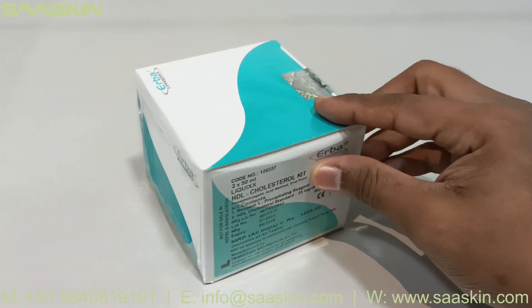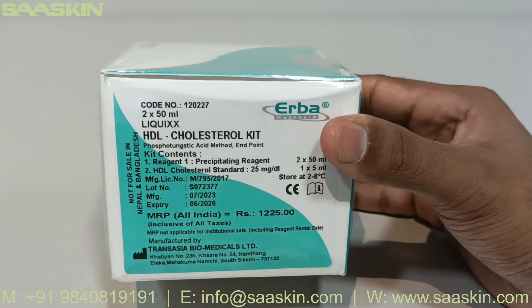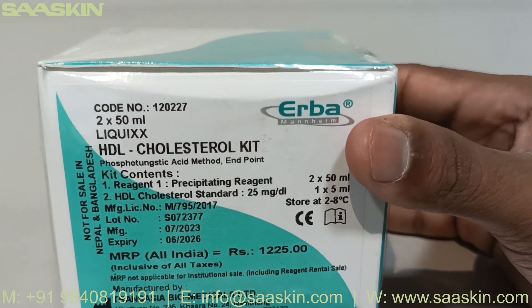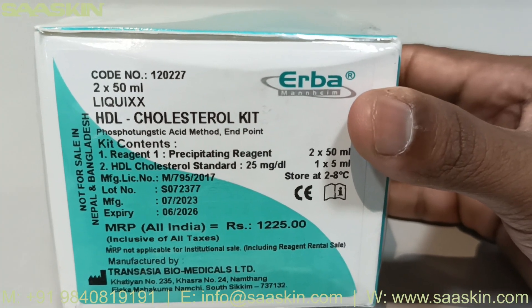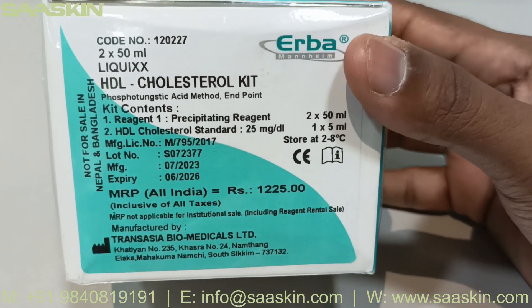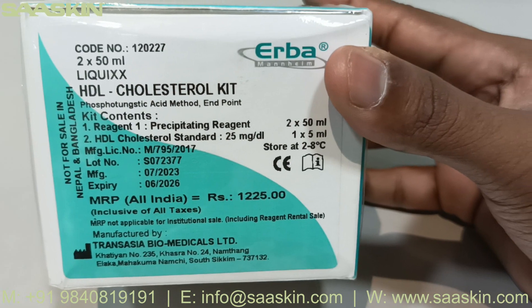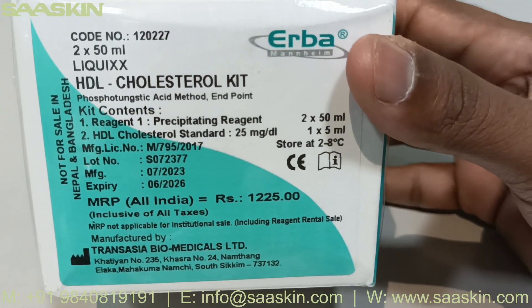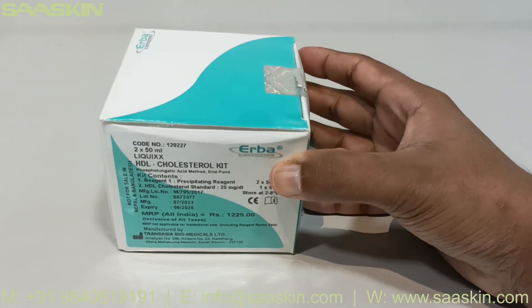To sum it up, this is Erba Mannheim's HDL cholesterol kit with a pack size of 2x50ml and catalogue number 120227. It uses the phospho-tungstic acid method and contains a precipitating reagent of 2x50ml volume. The HDL standard concentration is 25 mg per dL with 1x5ml volume. It has a standard expiry of 3 years, is CE certified, and must be stored between 2 and 8 degrees Celsius. Thank you.